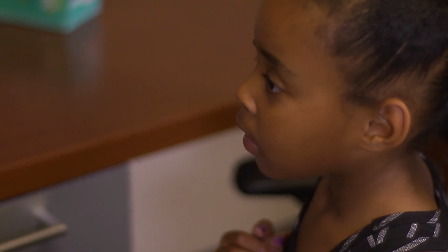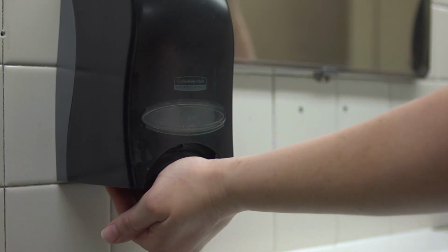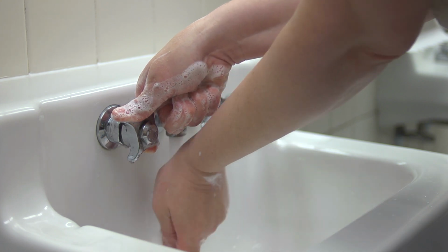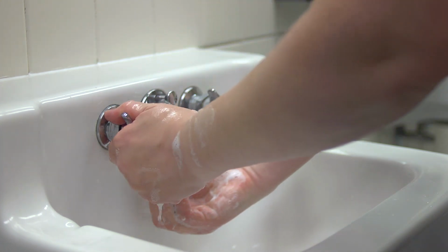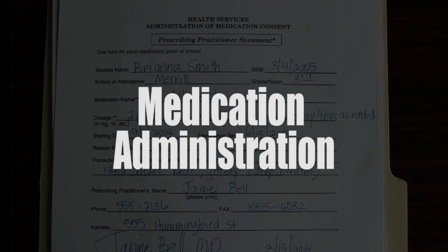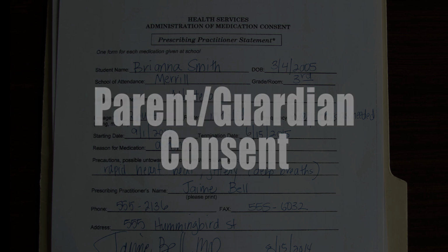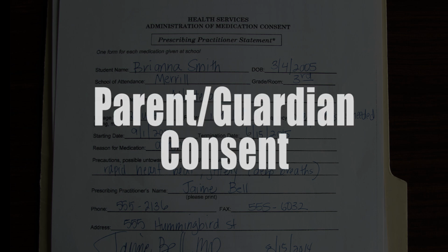Position student, providing as much privacy as possible. Wash hands. If student will be administering medication, have student wash hands. Check for authorization forms or record. Review the medication administration form, the medical provider form, and the parent or guardian consent form.